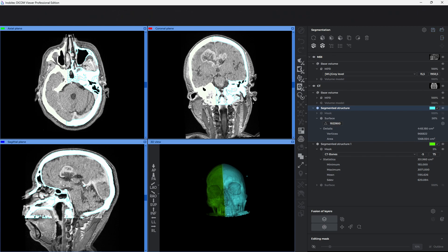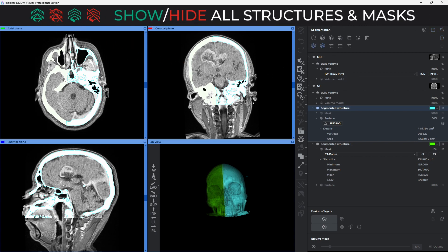In order to maintain the useful feature of hiding or showing all surfaces and structures, checkboxes have been transformed into icons.